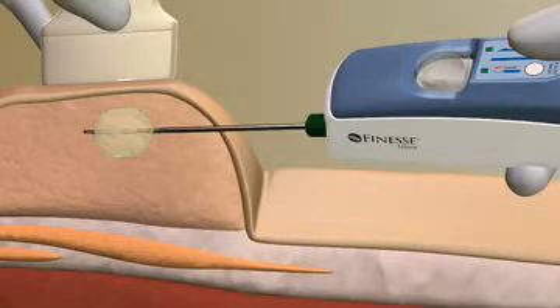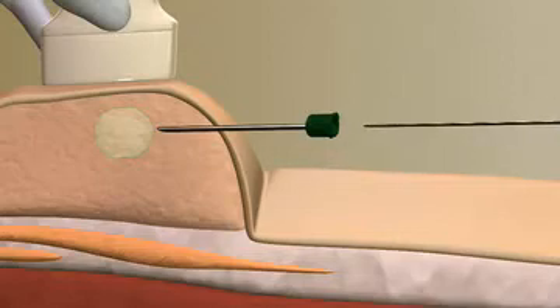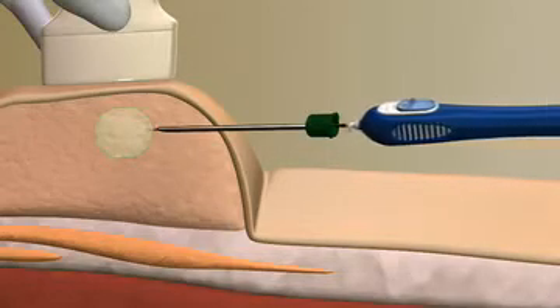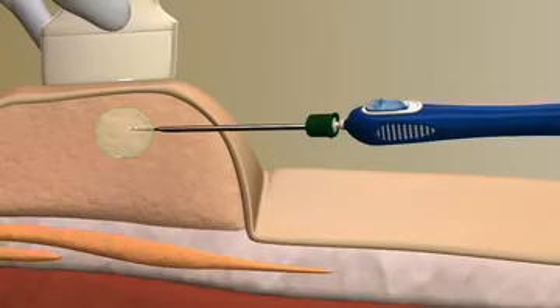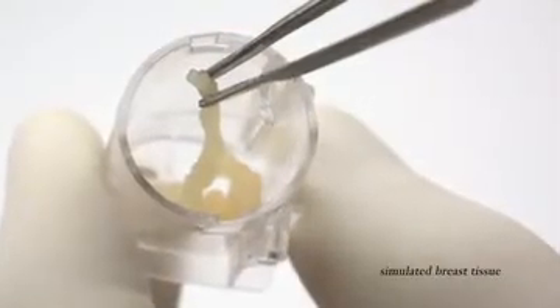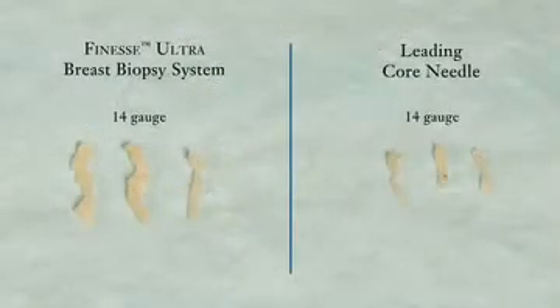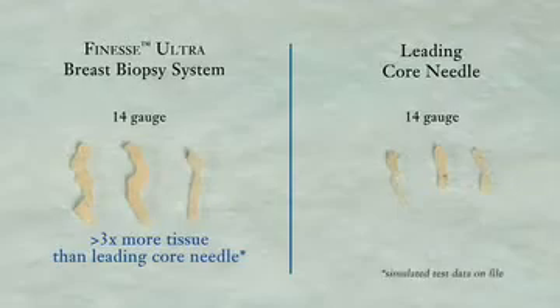When you have collected the desired number of biopsy samples, the integrated coaxial cannula can be detached and the probe removed, leaving the coaxial cannula behind to easily place a Bard UltraClip breast tissue marker. Simply twist off the sample container lid to remove tissue samples. With these larger, high-quality contiguous tissue samples, your pathologist needs fewer samples for a confident diagnosis.